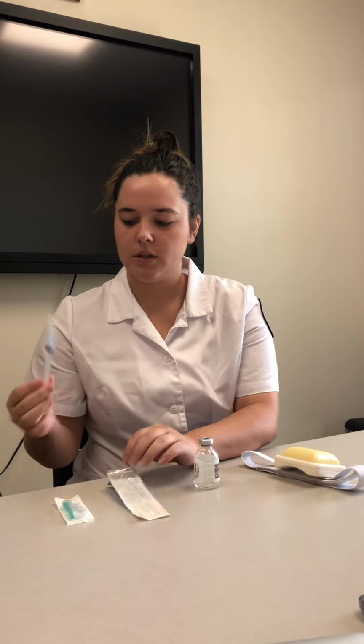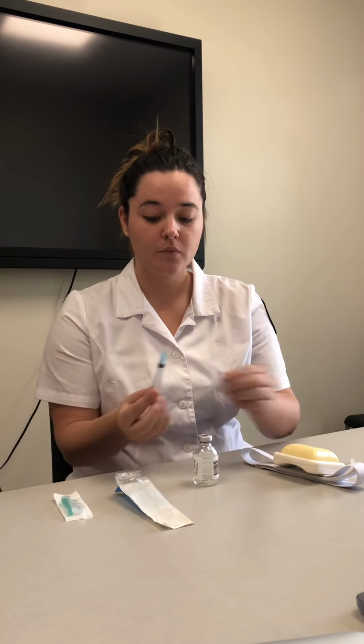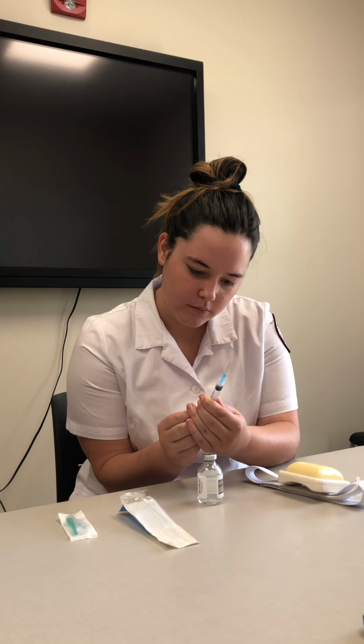So I would get my alcohol prep and I would wipe off the top of my vial. And I would get my medication out, my needle. And so now we're going to pull up 0.8 milliliters of air.